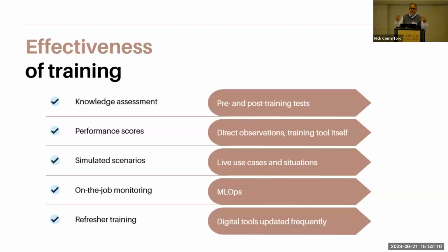J&J in Cincinnati has a large training center. At SAIS, we had another training center where we brought in surgeons. Aside from the cost perspective, the effectiveness of these augmented reality training tools is much higher. And because it's personalized, each surgeon can progress at their own pace, at different levels of difficulty. And as new features are released, new versions of your devices, you're not having to retrain. That's all in the tools they already have.